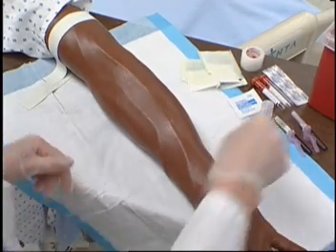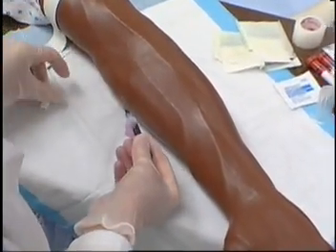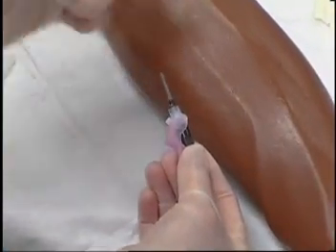Screw double-ended needle into plastic adapter with shorter needle facing plastic adapter.